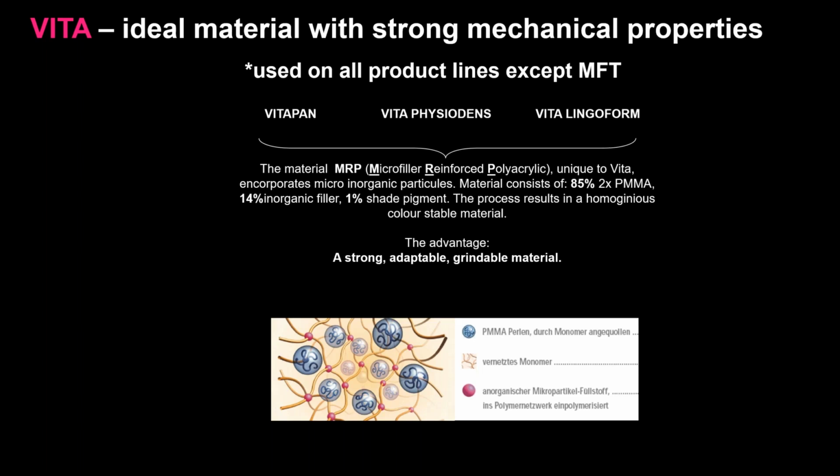But the trade-off is this. You get good looks, you get enamel qualities, an enamel look like a real tooth. It's hard. So the shelf life on this, meaning the wear life, that I see repetitively now in my practice is 7 to 10 years. But the trade-off is this.